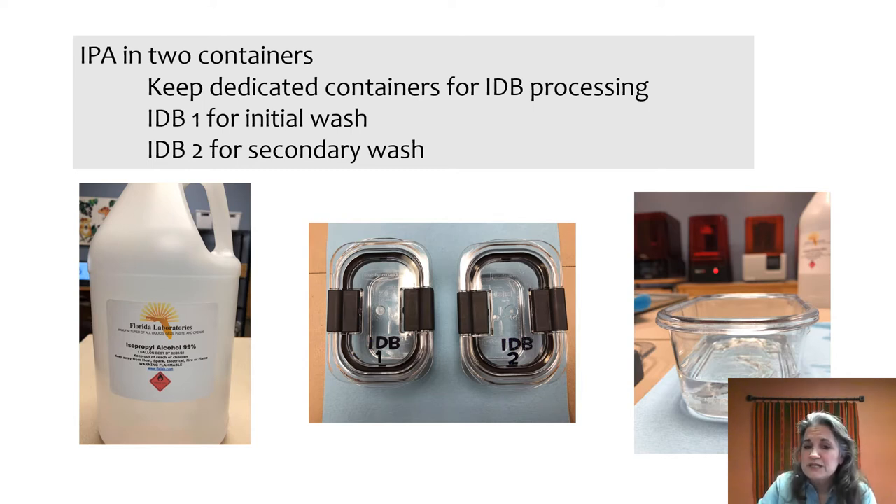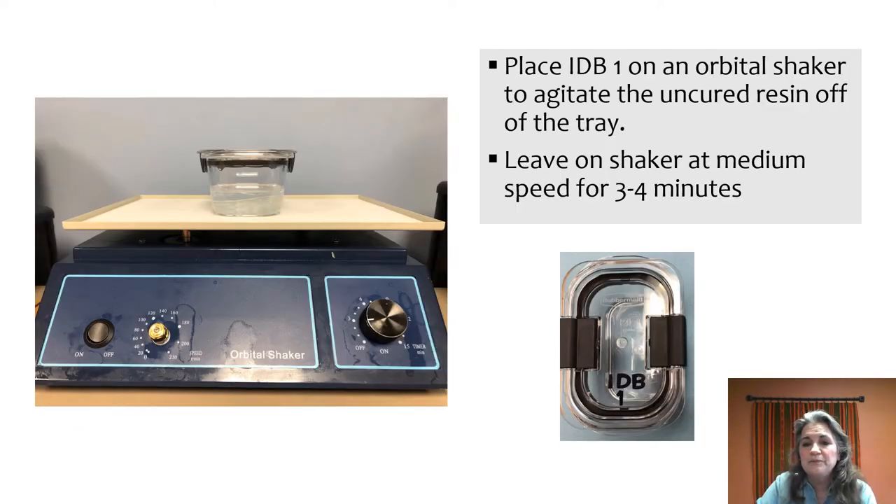You're going to have several containers. We like to label them IDB1 and IDB2. As soon as the tray is removed from the build platform, place it in the first container, because you'll find that the resin is really viscous and there's a lot to remove. We put it on an orbital shaker — whatever system you use to agitate your models will work. We use these Rubbermaid lunch containers; they're leak-proof, which is great for containing the alcohol.